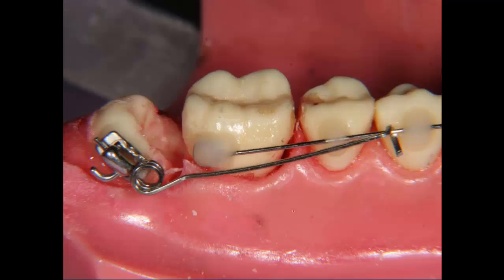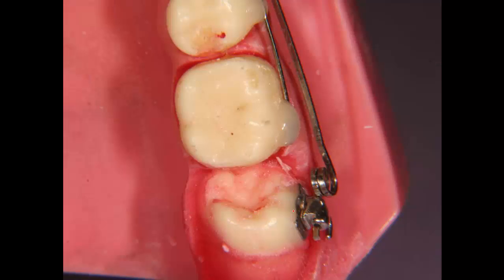All right, there's the way it looks after the activation. But you do the activation in the mouth. You don't do it and then try to put it in. It'd be very difficult. Now there's your little tube you put on the side of the tooth. It has to be on the side of the tooth, and this tooth will just come straight up out of there.